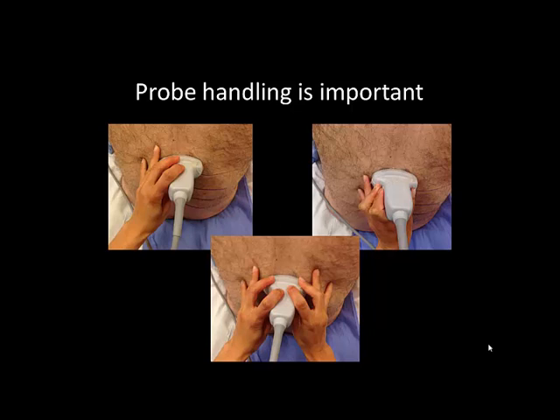Novices may find a two-handed grip easier, but with practice a one-handed grip may be sufficient. Ensure that the probe hand is braced against the skin of the patient's back to prevent inadvertent slipping of the probe.